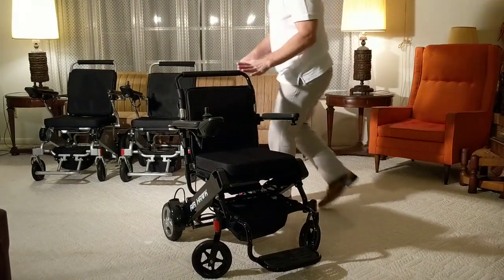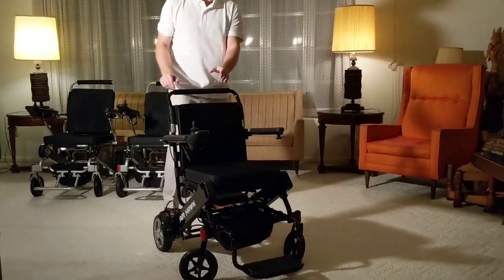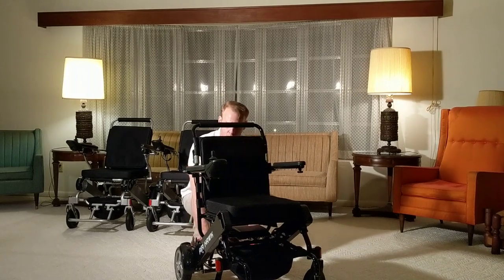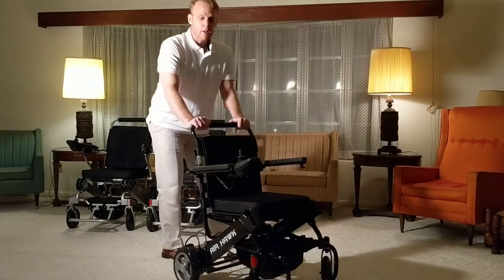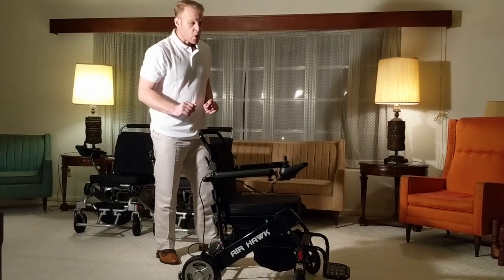The Airhawk has powerful electromagnetic brakes — it's very easy to stop and very easy to adjust. And at just 23 inches wide, you can get in and out of doors that are even in a trailer home.